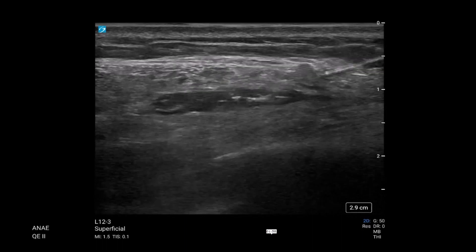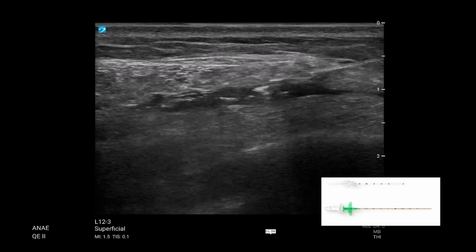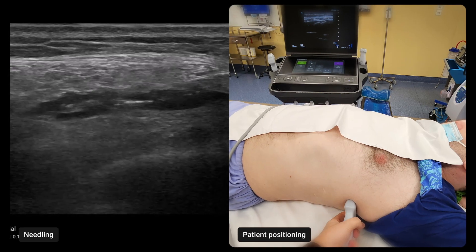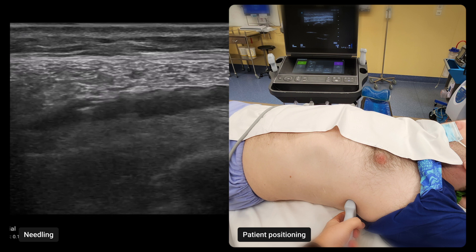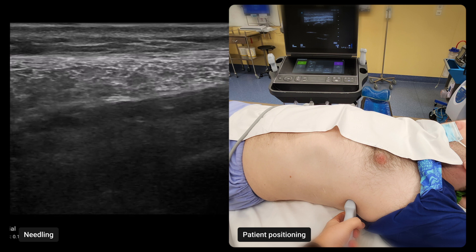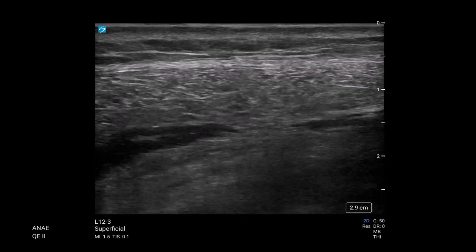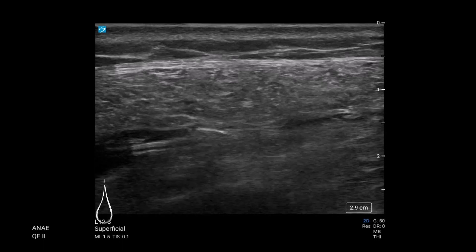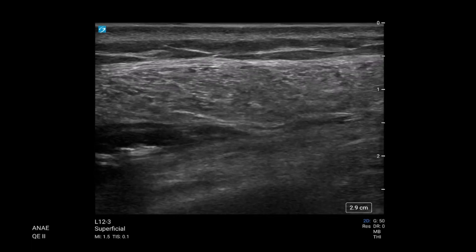Popping in with our catheter kit — this is probably a Suie-Cath — opening up some more space, readjusting and moving forward with the needle into that space. From here on, any further forward movement — going anterior to posterior on the patient — is pushing that catheter within the fascial space, certainly a number of centimetres. We'll try to chase that posterior border as far as we can. We've placed the catheter and are doing a post-catheter scan confirming location and spread of local anaesthetic. I quite often place these with saline and then put all the local through the catheter.